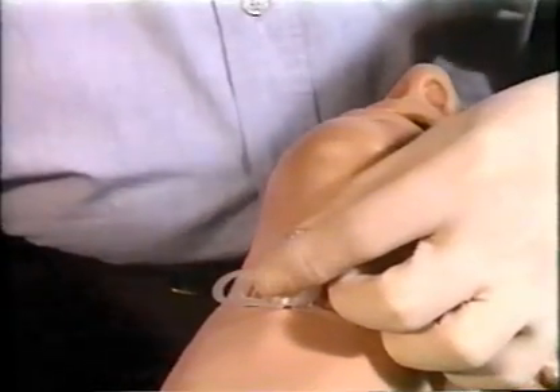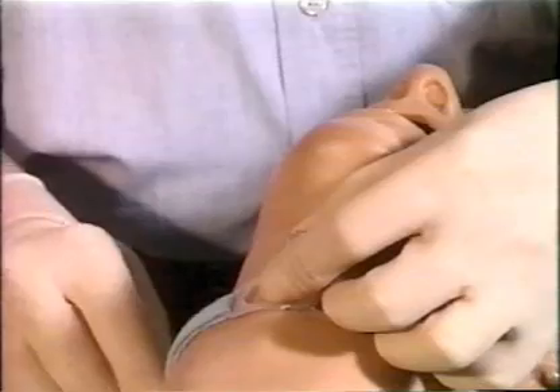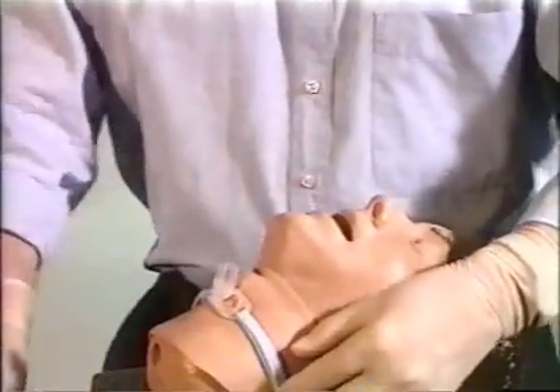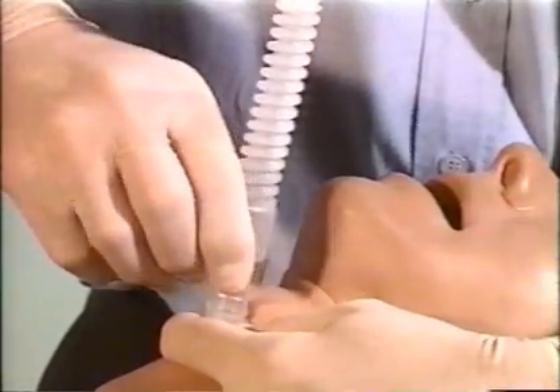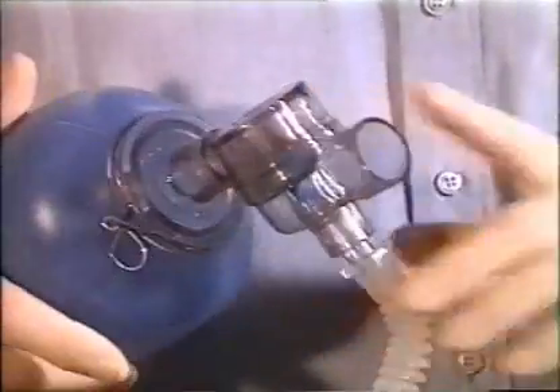The fixation flange is secured to the patient's neck with the padded strap. To ventilate the patient, the connecting tube is connected to the 15 millimeter connector on the plastic cannula. The other end of the tube is connected to a ventilation bag or system.